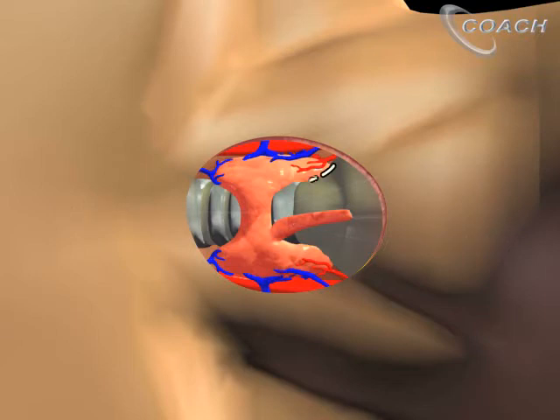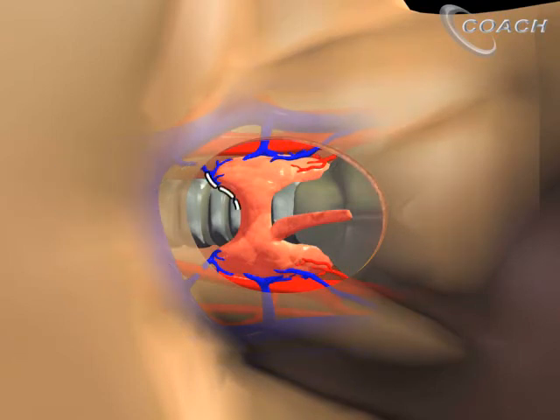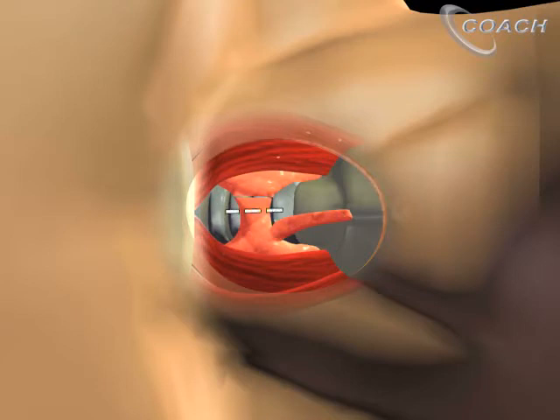Our first step is to divide some of these attachments superior to the isthmus. At this point, we'll oftentimes divide the inferior thyroid veins, or the ima veins, and then we'll divide the tissue inferior to the isthmus. Next, we'll transect the isthmus flush with the contralateral lobe. If you're doing a total thyroidectomy, you can divide it in the midline.